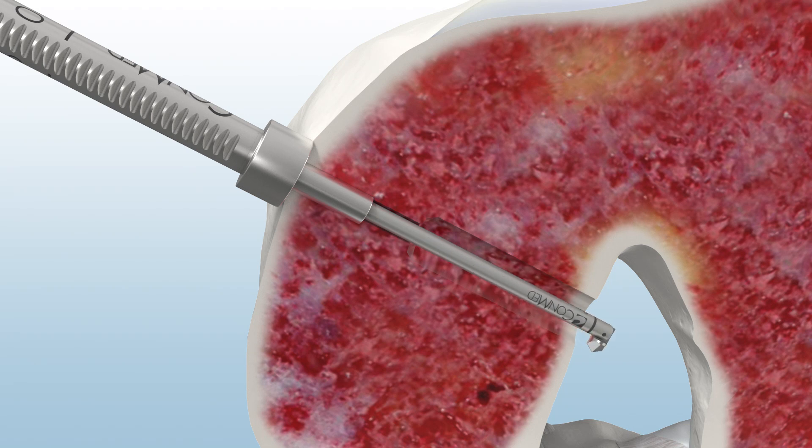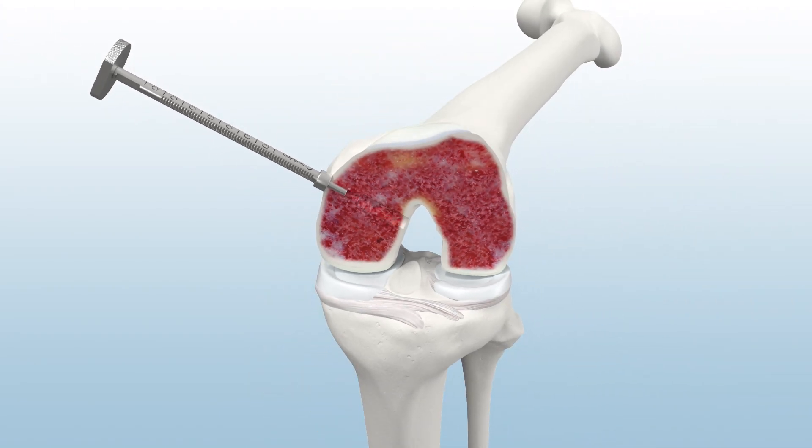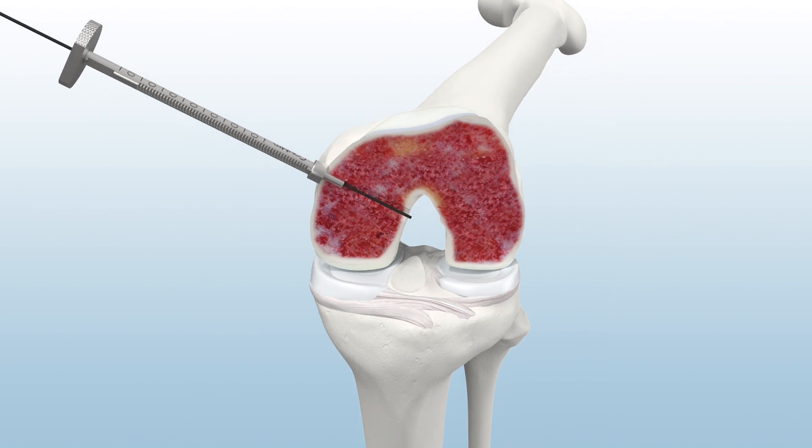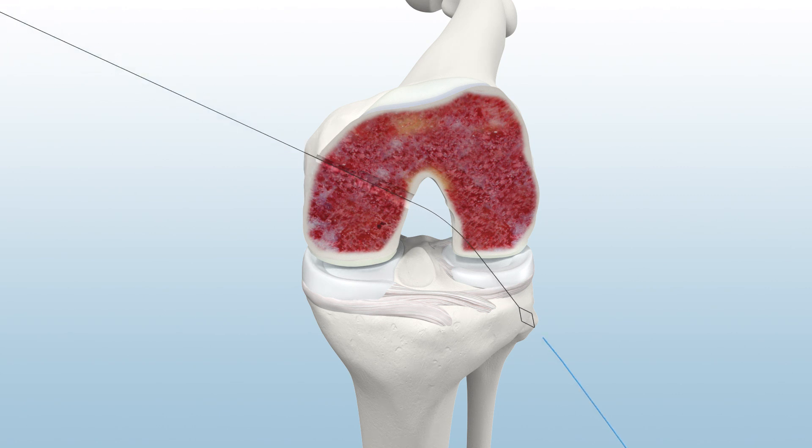Switch the Retro Reamer back to Inline Mode Drill Mode and remove from the joint. To facilitate suture passing, insert the Infinity Suture Shuttle and retrieve the nitinol loop out of the anterolateral portal.